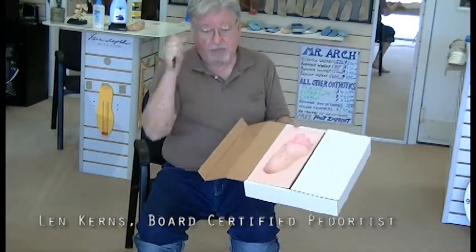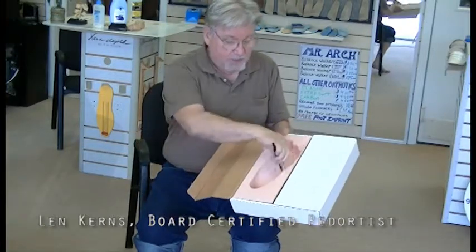So this is what we consider a good cast, and when you see the movies on casting on my platform, and you put this together with how I modified the cast, this is where we get all the hundreds of points of the angles of the forefoot, how high the arch is, how high it is over here. After we pour the cast, we would then put the cast completely back up in the air, which you saw in the other movie, and this first metatarsal would be off the ground, relating to how good Mark took the cast.